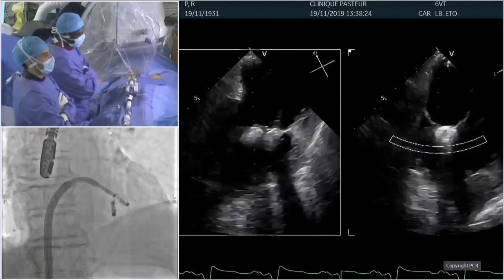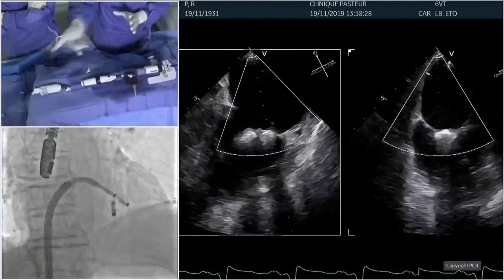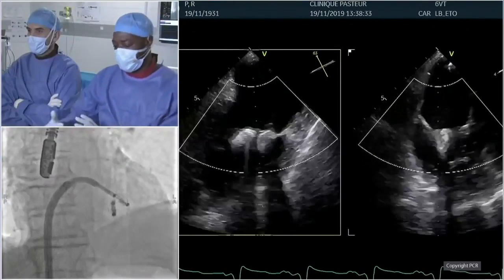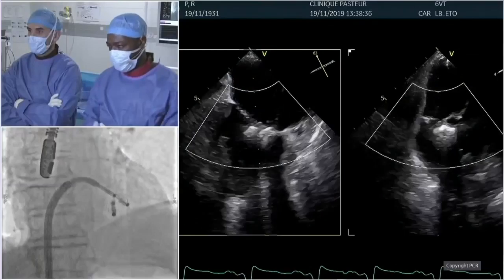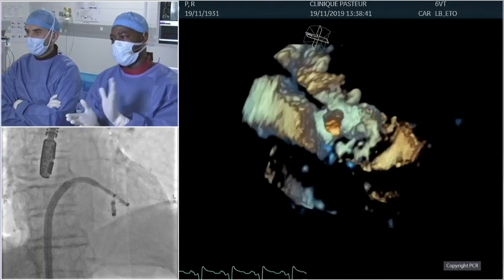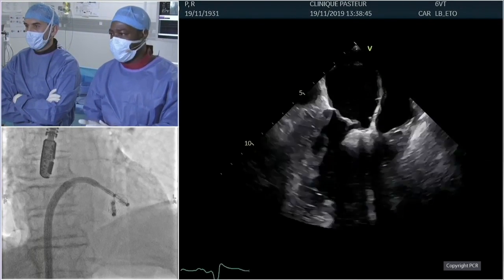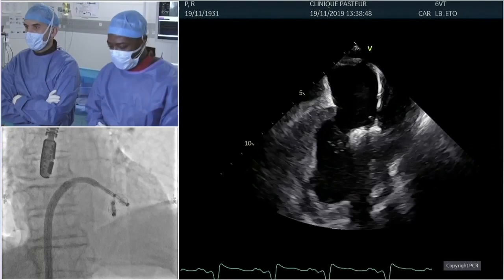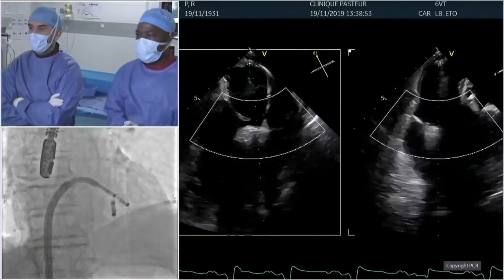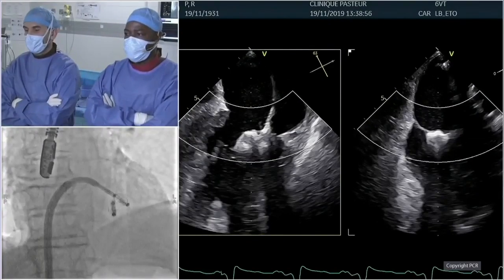And to be honest, here the ability to have that differential capture of the leaflet was really useful for the second one, because we were once again able to capture more the posterior, and we had to work with a slightly better trajectory to go towards the anterior. And having the ability to both lift and put down the clasp from a differential perspective was useful. So correcting the trajectory. Yeah. Maybe you can show us the 3D that is useful for everybody to understand what we have done.